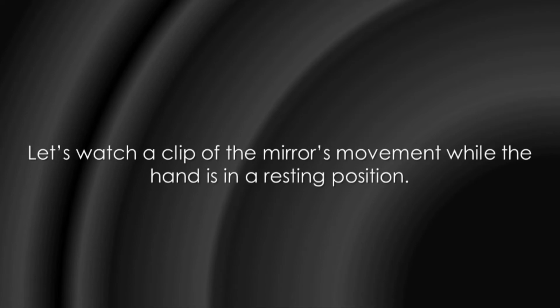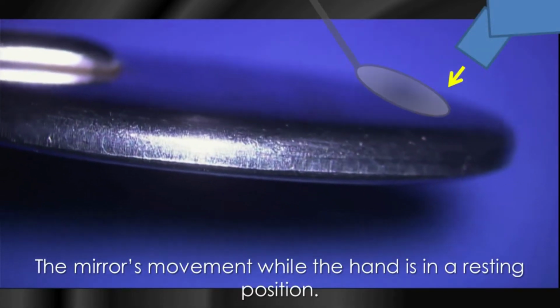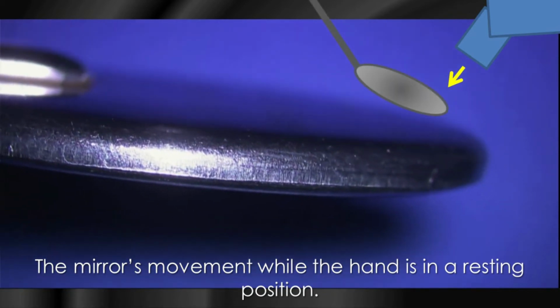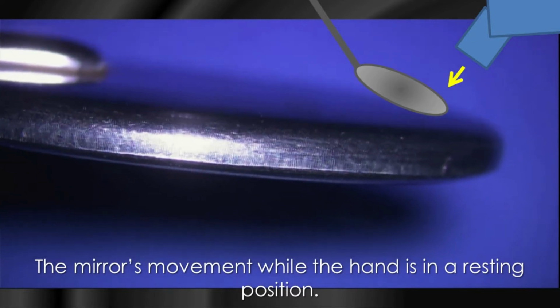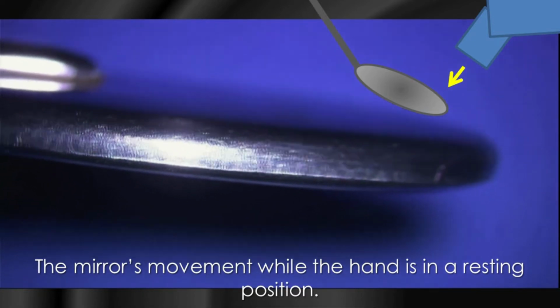Let's watch a clip of the mirror's movement while the hand is in a resting position. This is the mirror's movement, it vibrates a lot. So very difficult, accurate focus, as you can see.